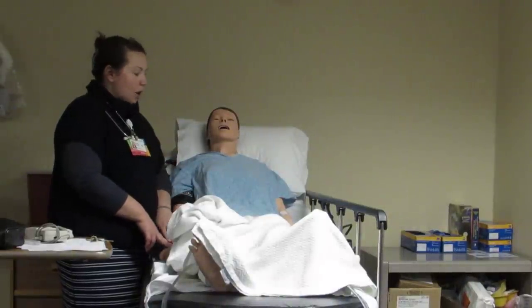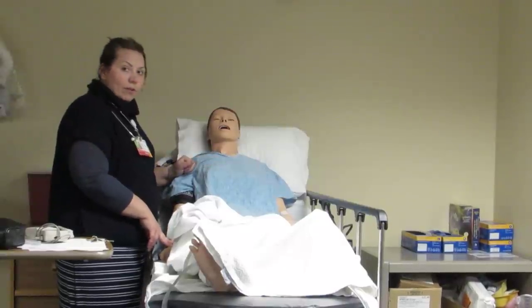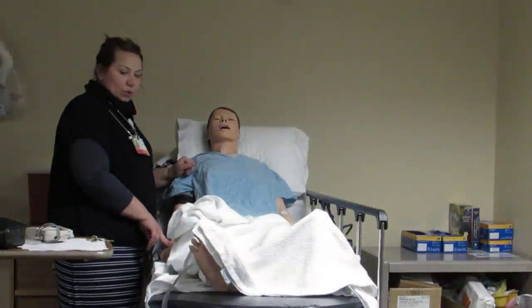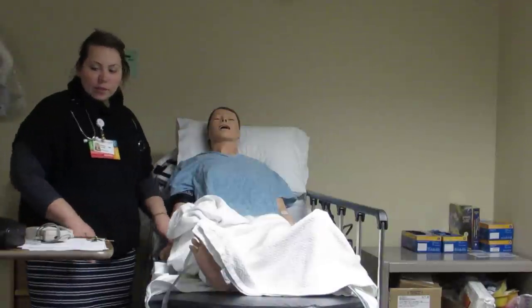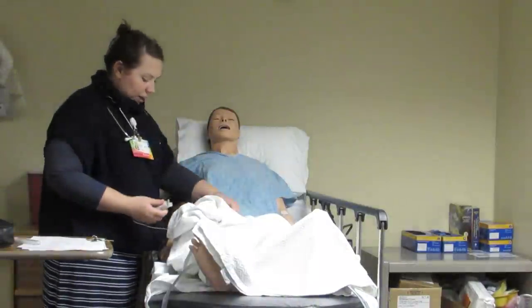I'm going to count her respiratory rate. Okay, so now I'm taking her heart rate for 30 seconds, multiplied times 2. Taking her respiratory rate for 30 seconds, multiplied times 2. Okay, Mrs. Smith, everything seems good. Just going to put this probe on the end of your finger to check your oxygen.